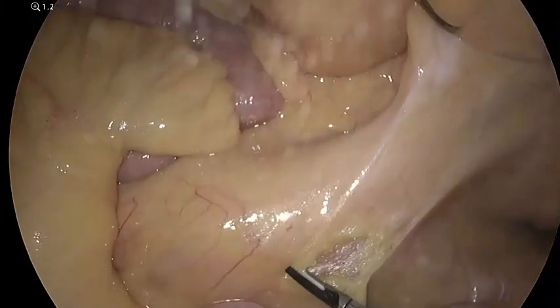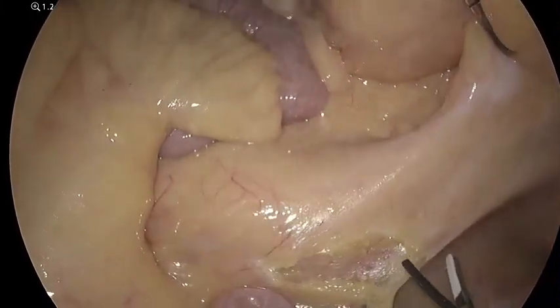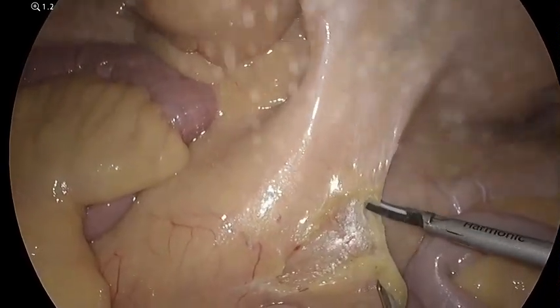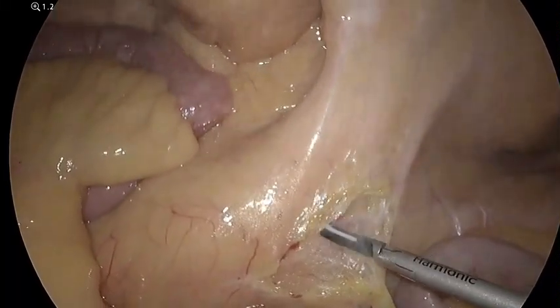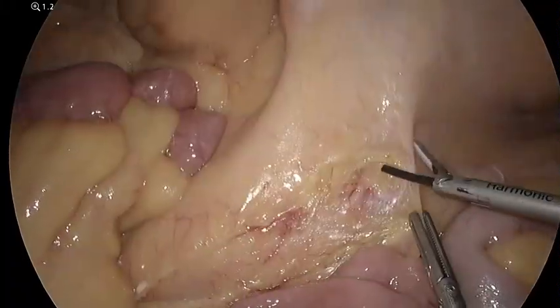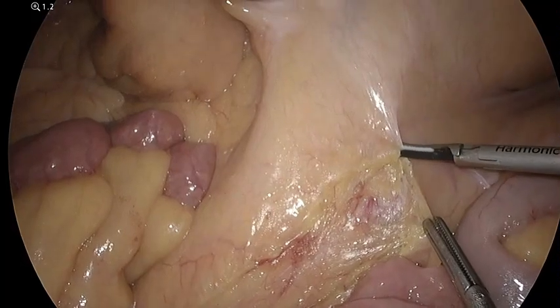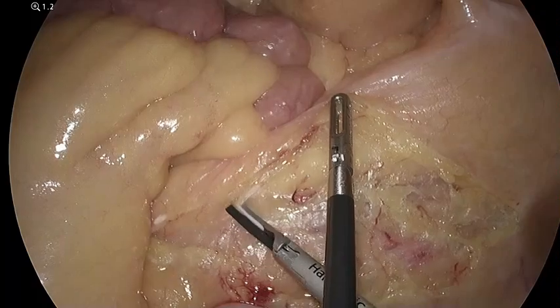Transect the left colic artery and the first branch of the sigmoid artery, preserving the main trunk of the inferior mesenteric artery. Transect the sigmoid mesentery along the projection from the inferior mesenteric artery to the mid-sigmoid colon, then transect the caudal end of the inferior mesenteric vein. Denude the sigmoid colon and transect it using a linear cutting stapler.